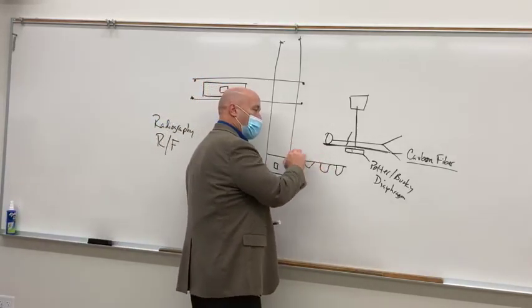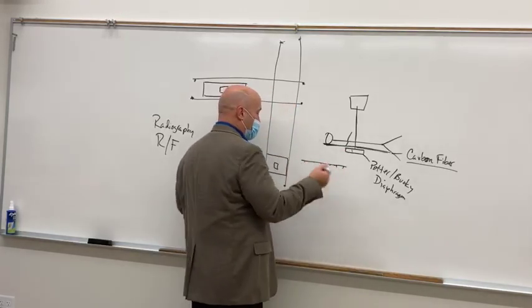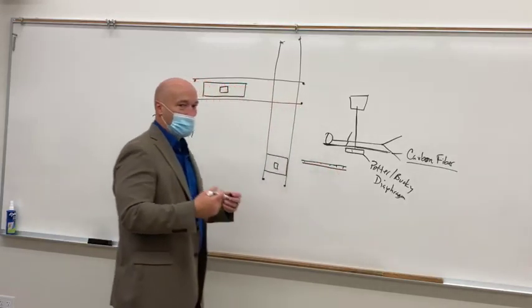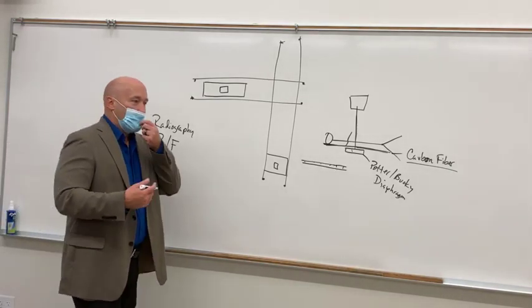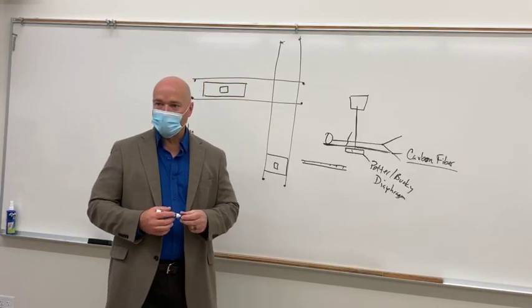So two characteristics of the tabletop we gotta have. One is that it's gotta be radiolucent, and the other is that even if it's radiolucent, we have to have uniform thickness so that we don't have those artifacts and have differences in density on our image receptor when we make our exposure, okay?